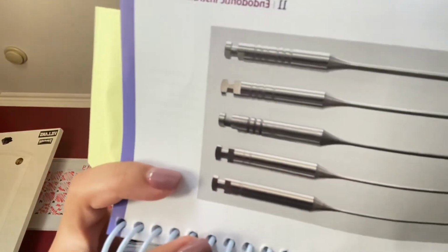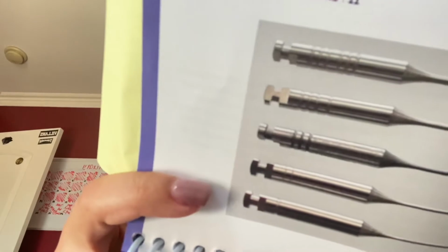And when that is done, the doctor will use the Gates Glidden to enlarge the walls of the pulp chamber and to help open the canal more. This Gates Glidden is used on a contra-angle. And then the doctor will also use reamer files, which look like this. Which looks like this.